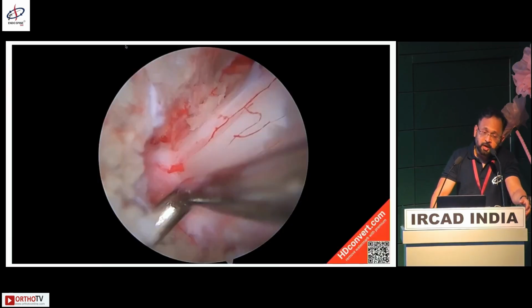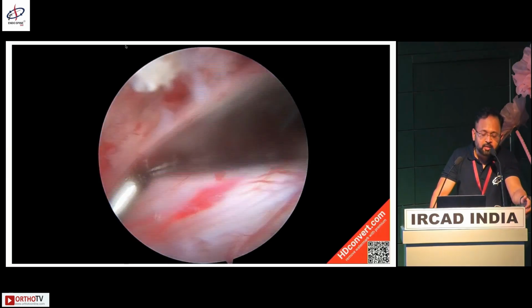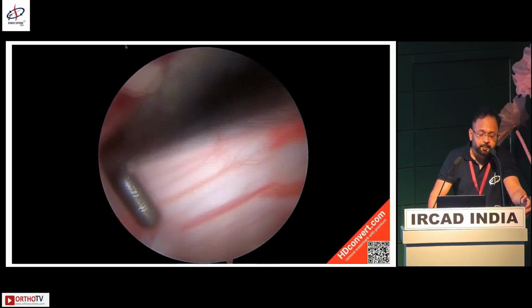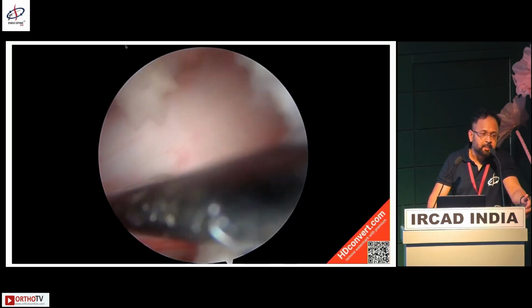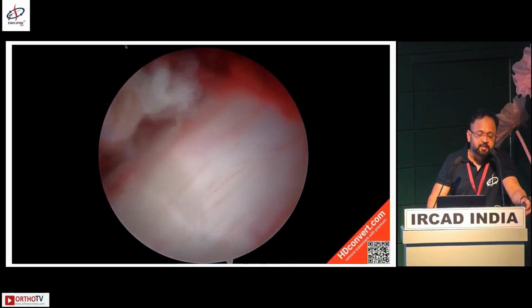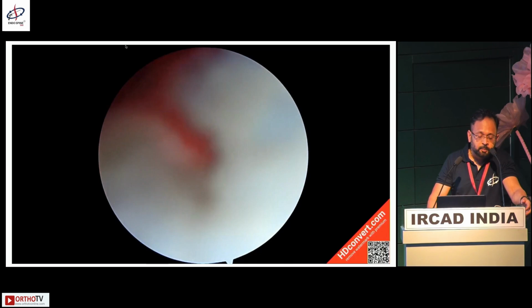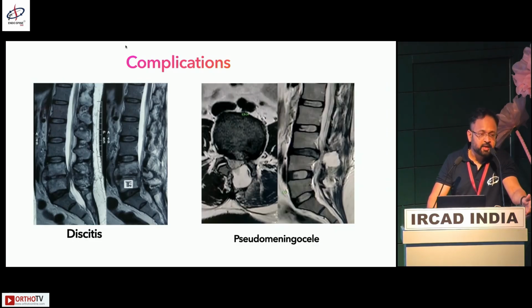Then comes myelopathies. When I had a stable OPLL, I was able to do a 3 level decompression of the cervical lamina with a single port because the laminae are just sliding. So you can do a C3 to C6 laminectomy with a single scar, with bilateral decompression.